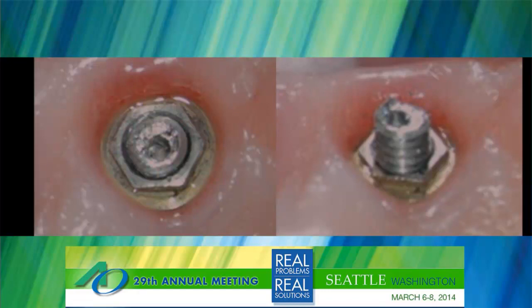Now you'll notice that the screw hole in this screw fragment is not quite concentric, and I probably had a little trouble getting the guide really centered on there. It turned out to be not an issue here because I'm still in the body of the screw and I'm not anywhere near the threads on the implant, so it was fine.